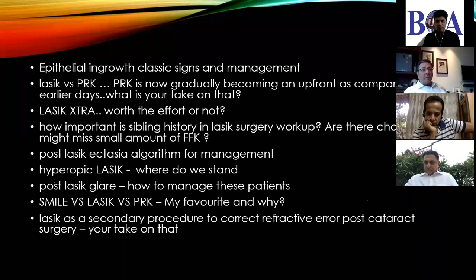Would you recommend using alcohol or something? No. A good old 15 number Bard-Parker knife. Fixate the flap properly with a sponge so that you don't rip off the hinge, and scrape your blade across the bed as well as the stromal side of the flap, and go right up to the edge of the flap, because that is where the epithelium has come in from. Okay, thank you.